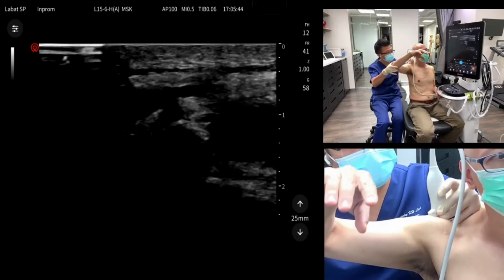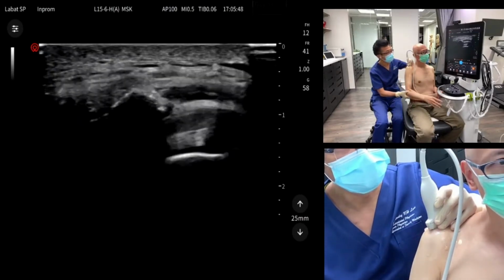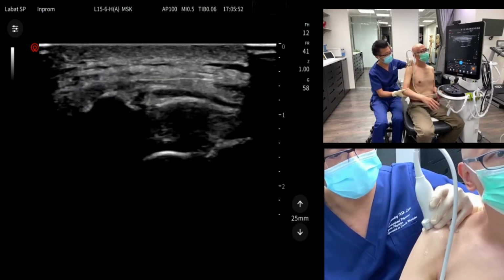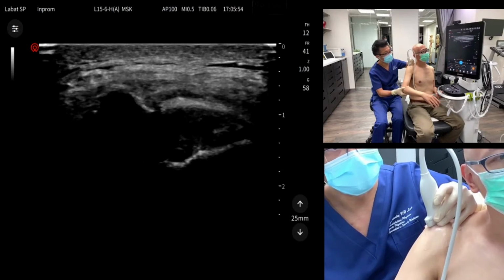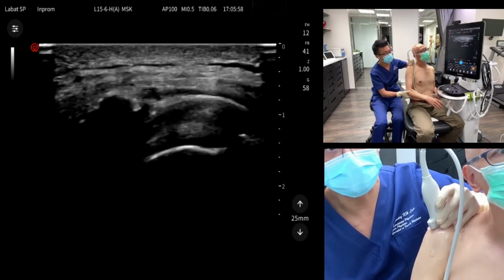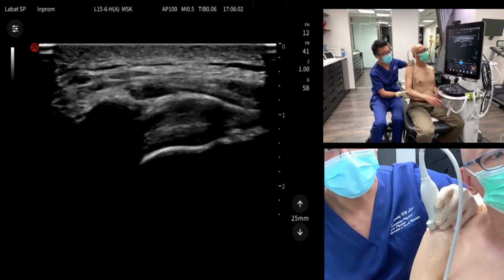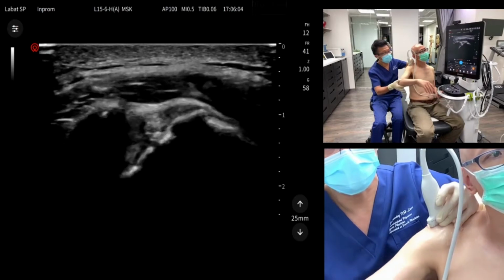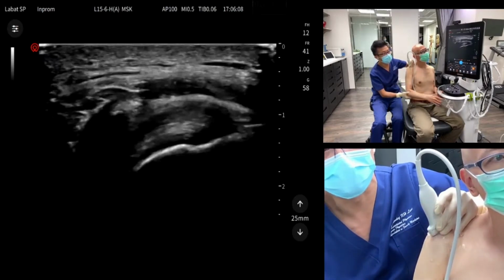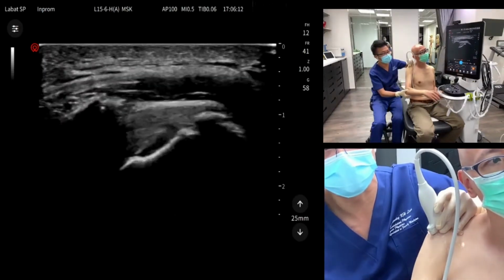So you can see, Robin, can you move a little bit more than that? And you feel a little bit of a clicking sound underneath, right? So this is basically in the initial phase of this abduction. You can see that there is bulging of the supraspinatus, or the rotator cuff tendon sheath, and the subdeltoid bursa has been pushed up by this supraspinatus tendon.